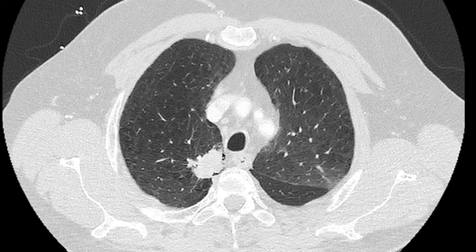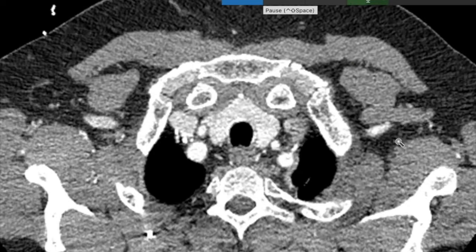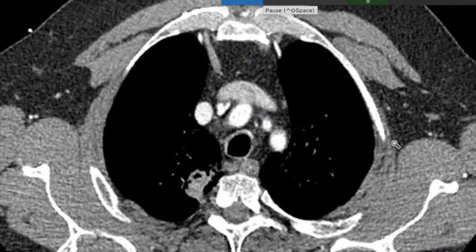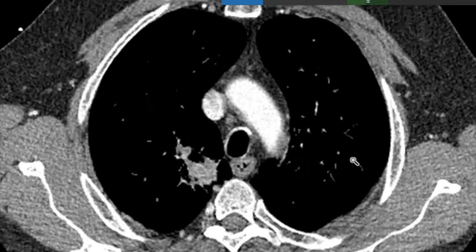I don't think there'll be access via the trachea. You have to remember that if there's only a sliver of air between the esophagus and the lung lesion, you won't be able to see it because ultrasound does not go through air — we need good apposition. Sometimes the esophagus can be pushed across a little bit to achieve that. Looking at the mediastinal windows, we can see the lesion and there's just a little bit of contact, so hopefully we'll be able to visualize it.